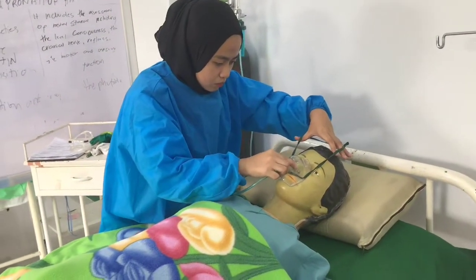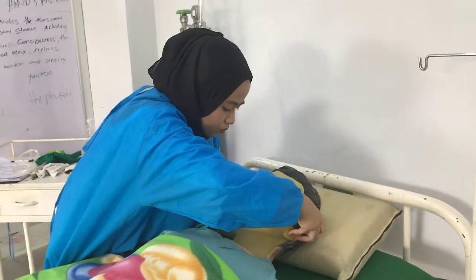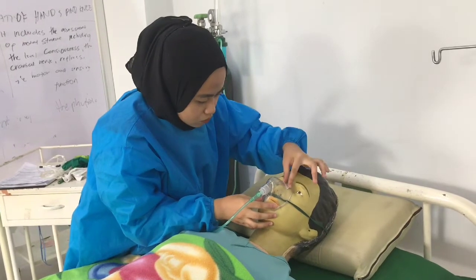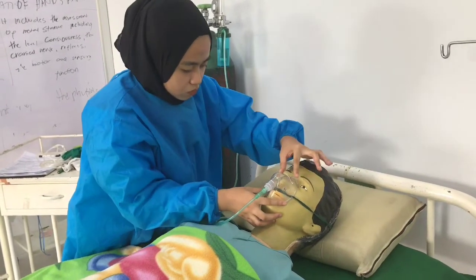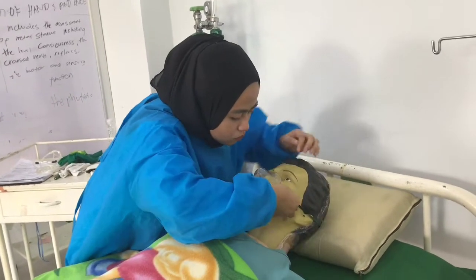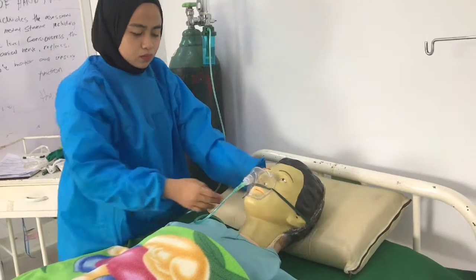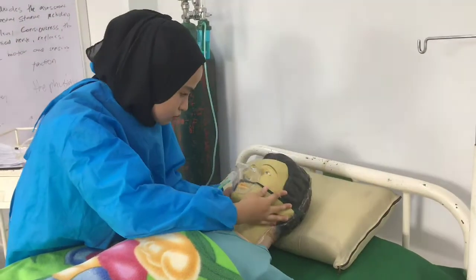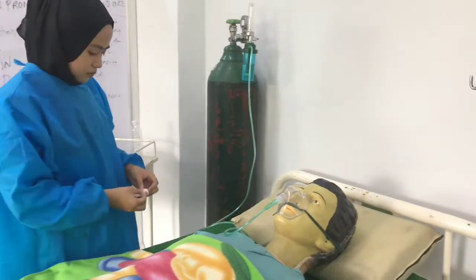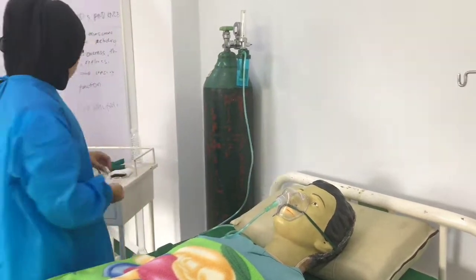Fit the mask to the contours of the client's face. Adjust the elastic strap around the client's head so that the mask fits snugly but comfortably on the face. The mask should mold to the face so that very little oxygen escapes into the eyes or around the cheeks and chin. Inspect the facial skin frequently for dampness and dryness and treat it as needed. This is to inspect for any abnormalities that need immediate attention.